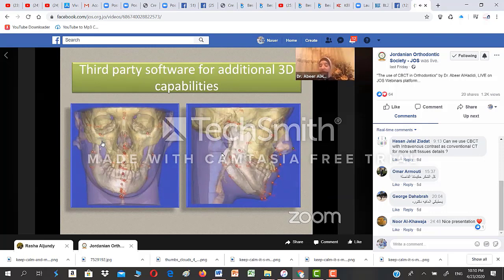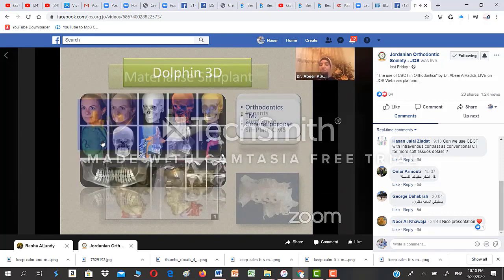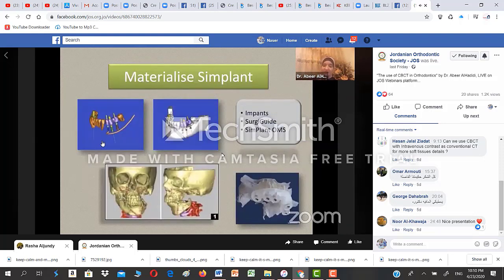So there are multiple software packages that have additional three-dimensional cephalometric capabilities, Dolphin 3D being one of them, and it helps by having all those modules that look into the temporomandibular joint, and maybe an orthognathic surgery type of module. Materialise also has those modules that go in the intersection between orthodontics and surgery, with all those reconstructive work and syndromic patients, which may be useful, and that goes into the digital dentistry world with designing and printing missing pieces or intermediate tools, I would say, in the treatment plan.